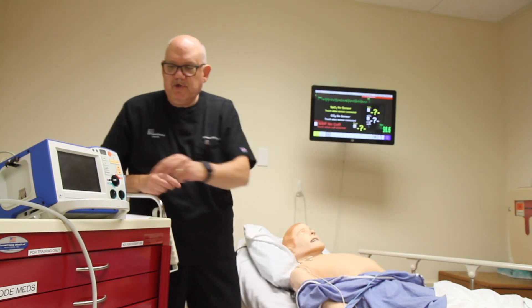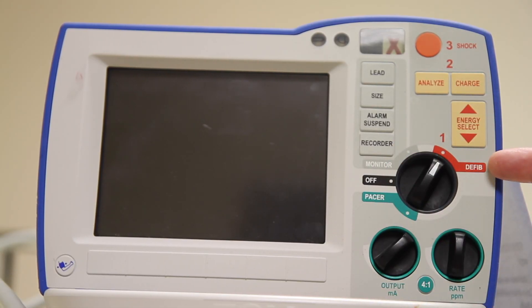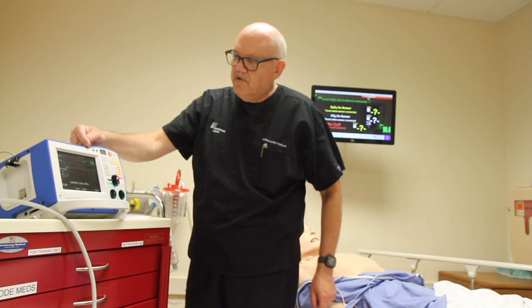I will then switch the device — step one — into defibrillator mode. I will confirm that it is looking at the proper device, whether it's the hands-free pads or the limb leads.